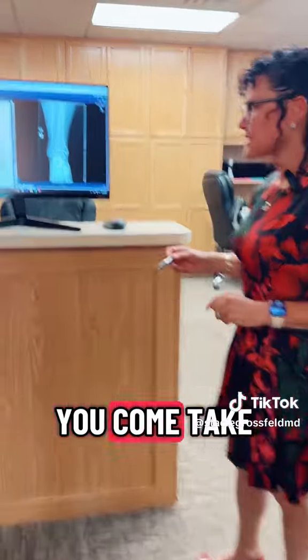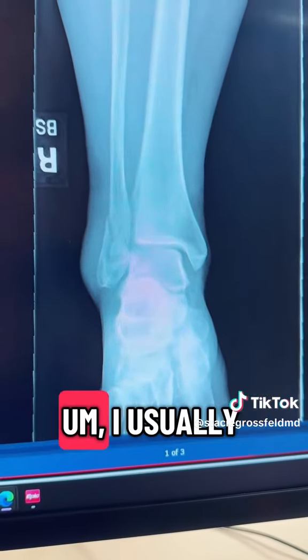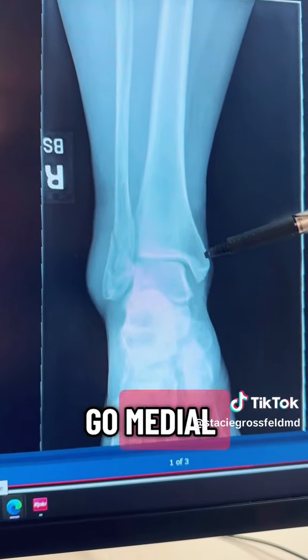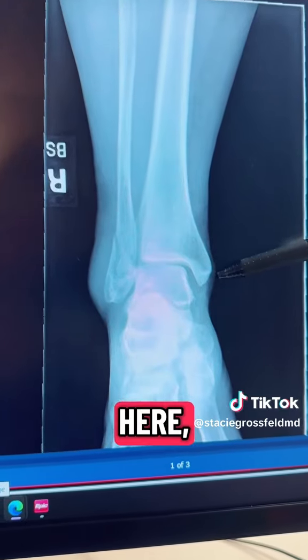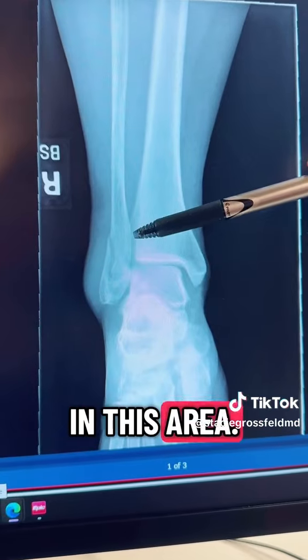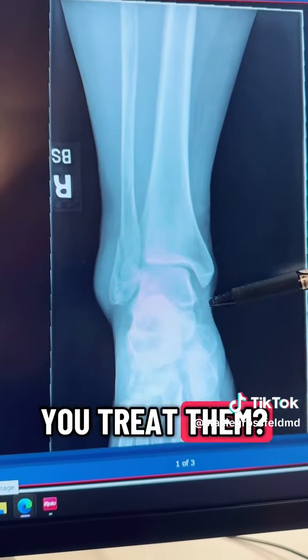So I'm going to have you come take a look at the x-ray. This is an AP of the right ankle. I usually will start at the top of the x-ray, bring my eyes down. I tend to go medial, and I look here, and then I shoot over to the lateral side, and I look in this area. What is wrong with this patient, and how will you treat them?